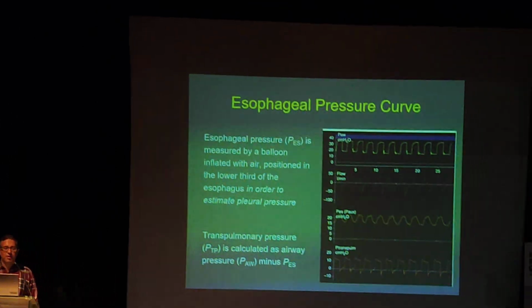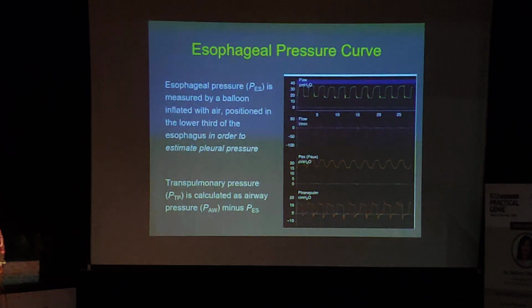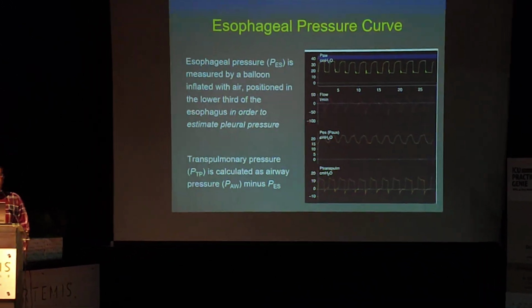Then coming to the esophageal curve, it is measured by a balloon inflated with air positioned in the lower third of the esophagus in order to estimate pleural pressure.